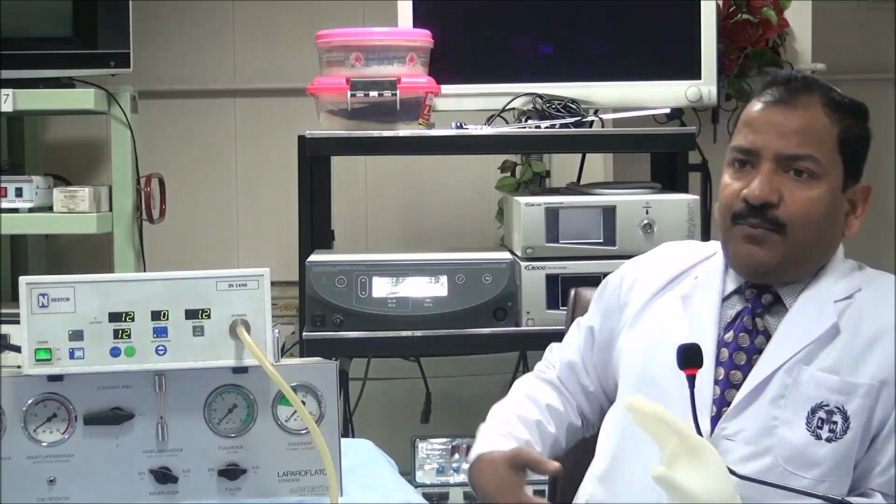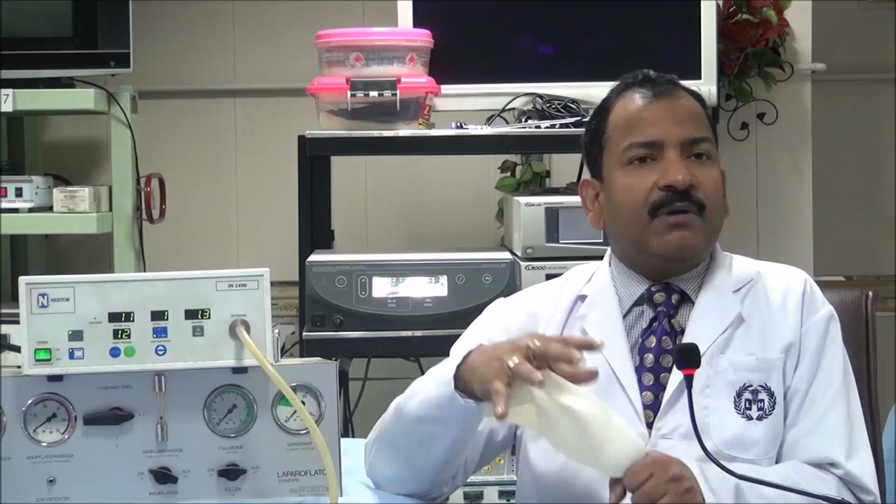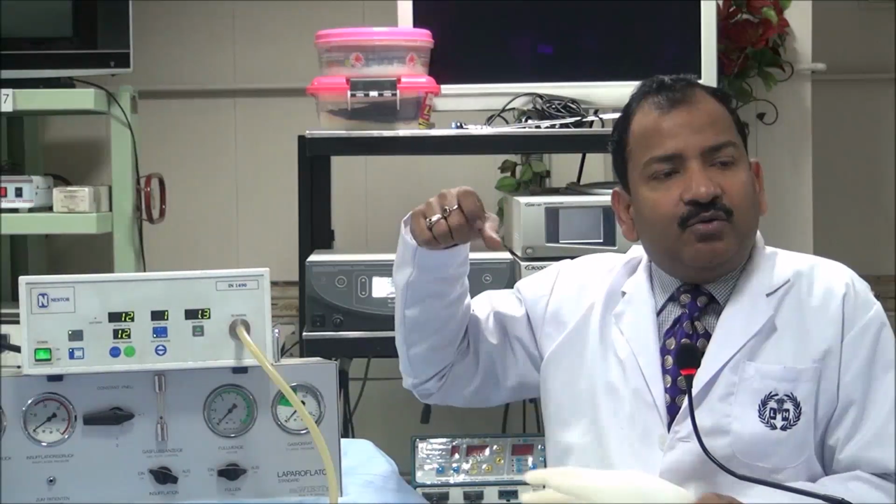The reason is, whenever you are putting your secondary trocars, the pressure always increases. Suppose my telescope is there and I am putting one trocar here. Due to the pressure of the trocar, the pressure will increase. And if the insufflator suddenly takes the gas back, then that trocar can hit the cecum or the bowel. So it will give you 5 seconds. Up to 5 seconds, there will be no alarm also. But as soon as you start hearing the alarm, you should stop and do a second attempt.